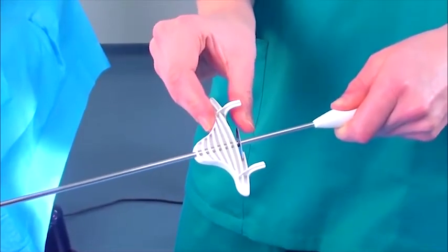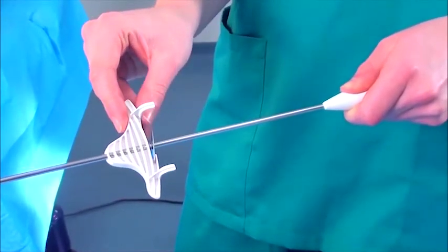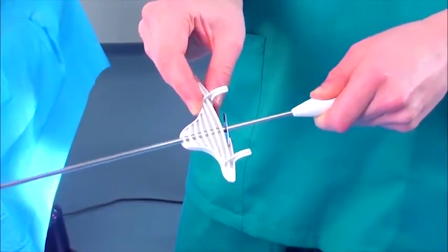While developing a single-use replacement, we also took the opportunity to improve the usability of the traditional complex clamping mechanism. Our self-locking design can be engaged one-handed and eliminates the need for awkward and time-consuming tightening of small screws.